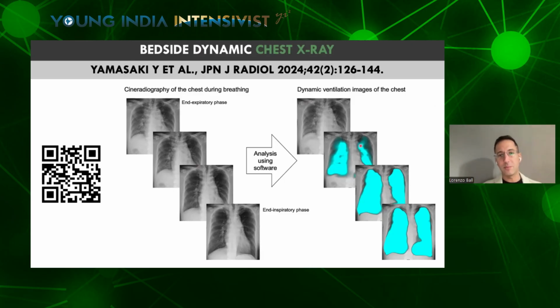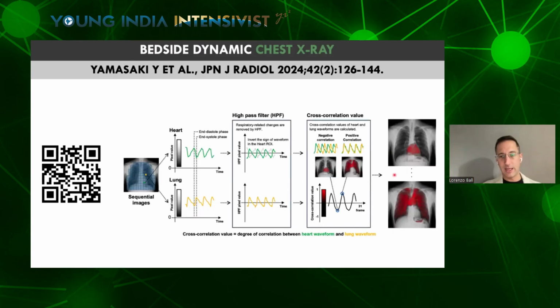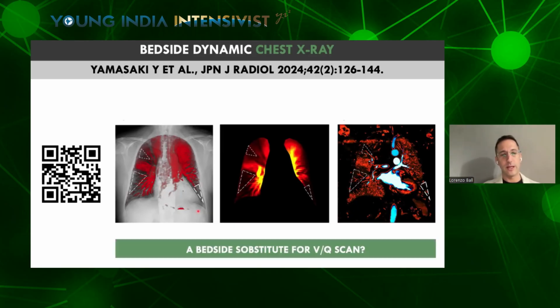So with some computer-based complex analysis, we can extract perfusion and ventilation images of the lung, and in the end obtain what we wanted, a map of the distribution of ventilation and perfusion. You see here an example of pulmonary embolism in which this non-contrasted chest X-ray allowed us to estimate the presence of 3 regions of the lung in which there was ventilation but not perfusion, and so probably due to pulmonary embolism involving 3 branches of the pulmonary artery.